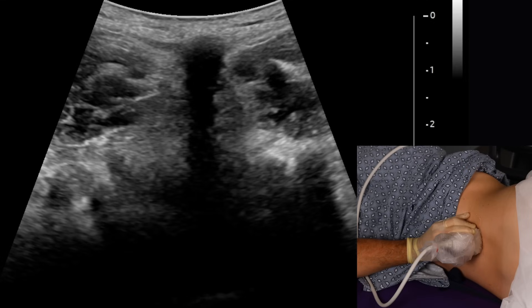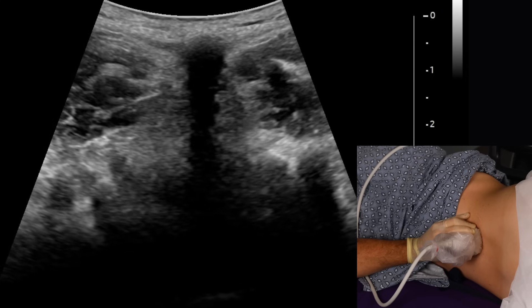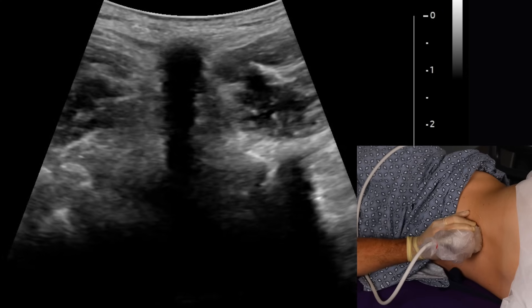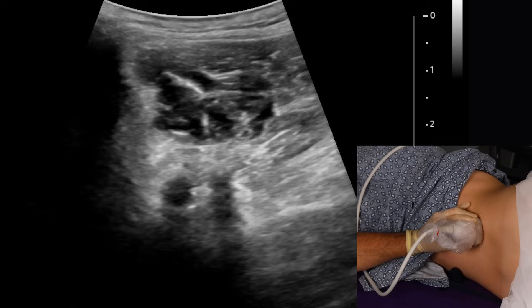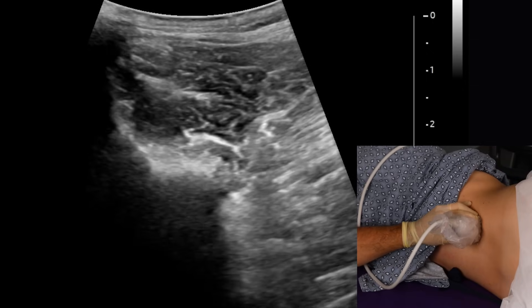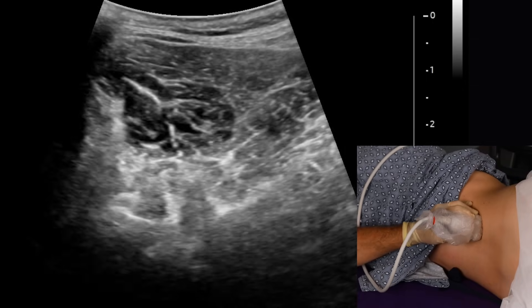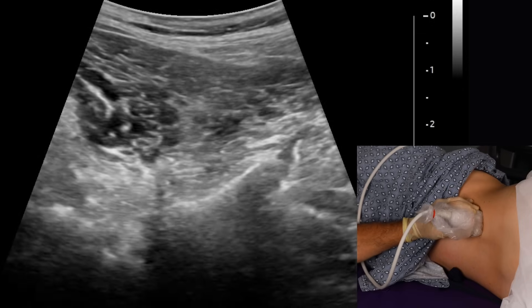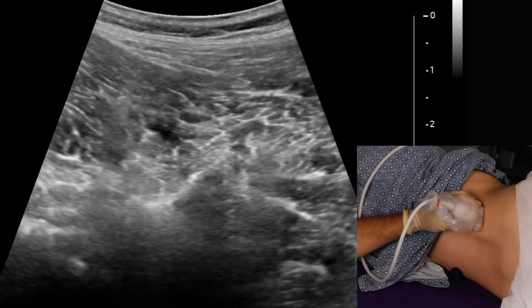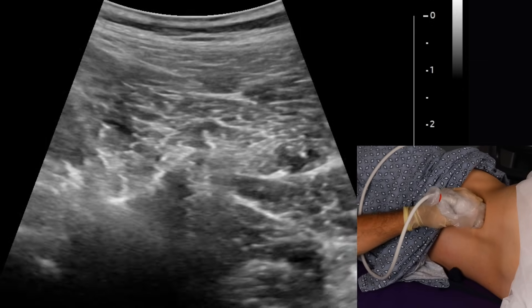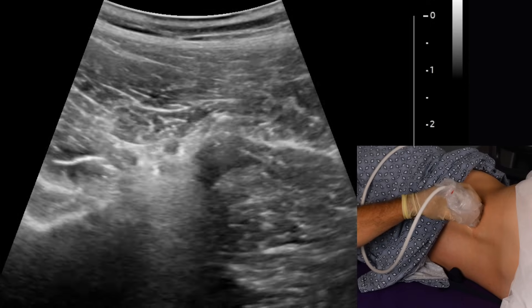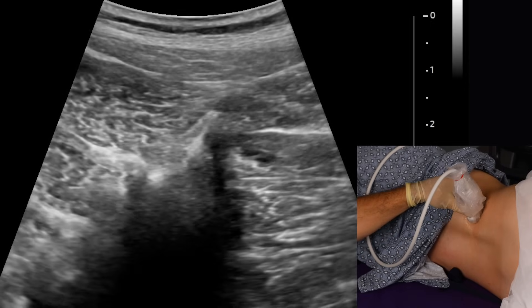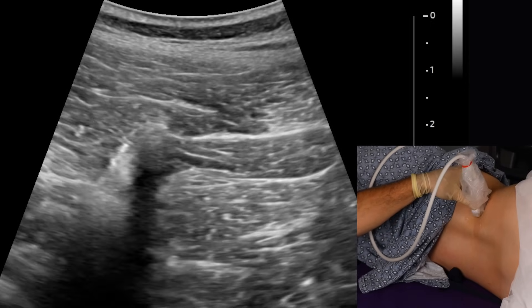Because we deal with a variety of body shapes and sizes, it's convenient to use bones as a starting point for scanning rather than soft tissue planes. Here we are in the posterior midline, and we can see the shadow of the spinous process. As we move off laterally, we see first the articular processes, then the transverse process sticking out laterally. The probe is rotated so the beam is directed back towards the paraspinal area, giving us a nice view of the TP flagpole, the QL flag, and the psoas muscle deep to that.